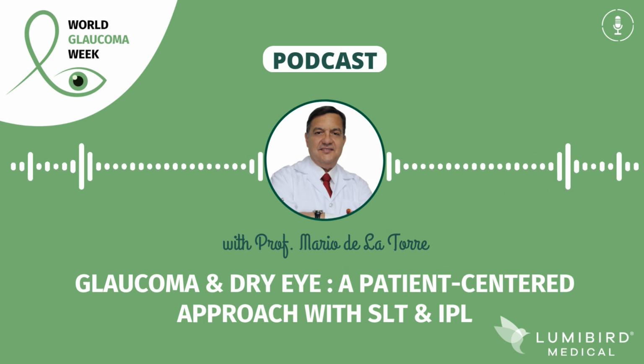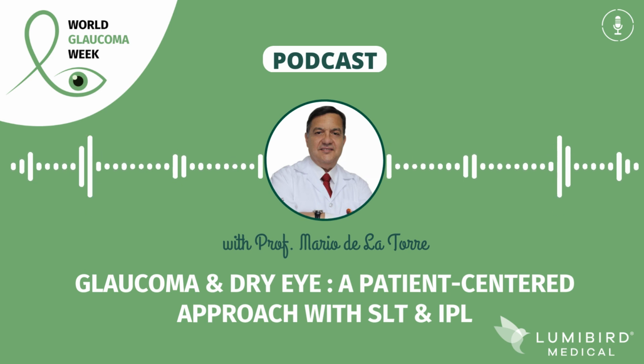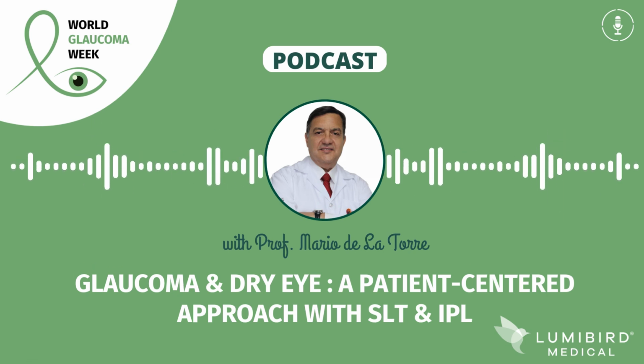Why we saw the double hump syndrome in UBM. This is very important. If you have more information, you have a better diagnosis. For sure. And we decided to get a more detailed view using the ultrasound biomicroscope, the UBM, rather than the anterior segment OCT.